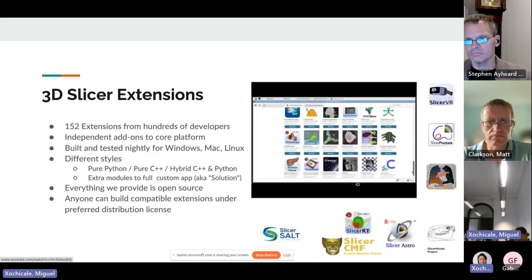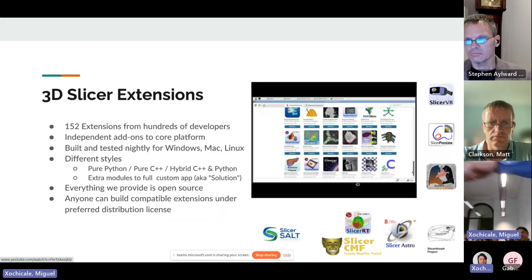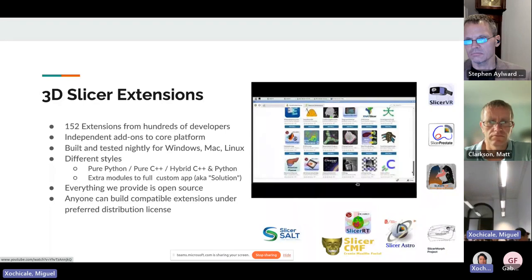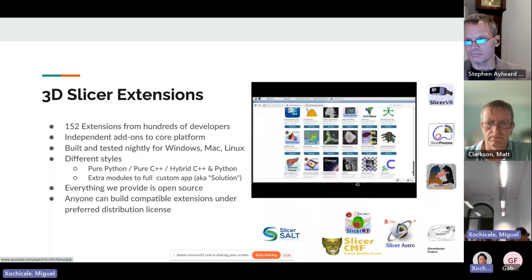Getting back to core Slicer, there are around 152 and growing extensions. The architecture tries to take anything that's application-specific or specialty-specific and put it into associated extensions. For example, Slicer CMF is for craniomaxillofacial surgery. We try to take concepts that belong naturally to a given environment and put them into extensions that are easy to download and install. We also have specialized core functionality you can build on, like Slicer VR for virtual reality — not something everybody needs, so we don't put it in the core.